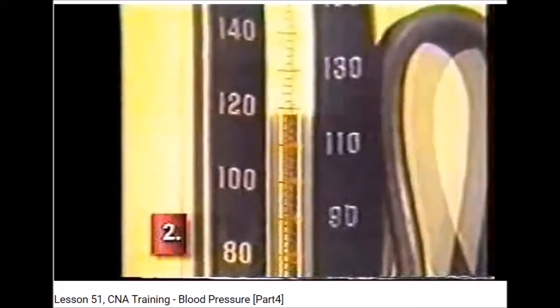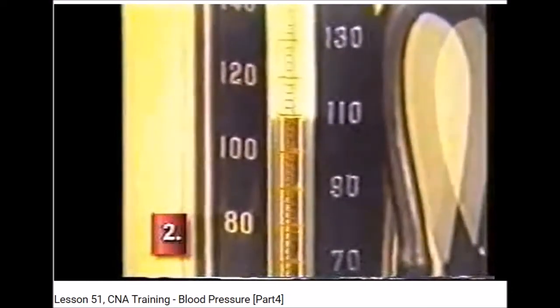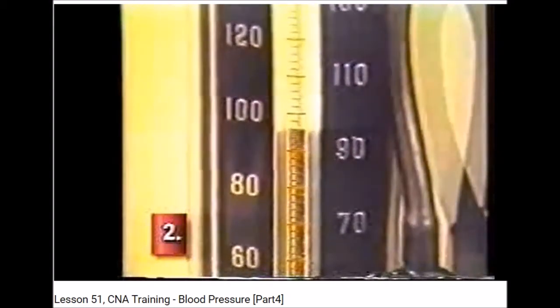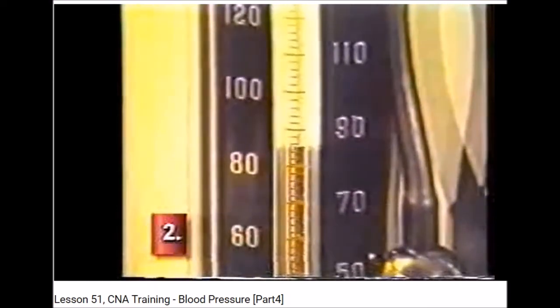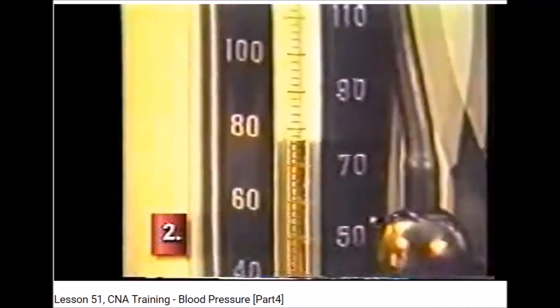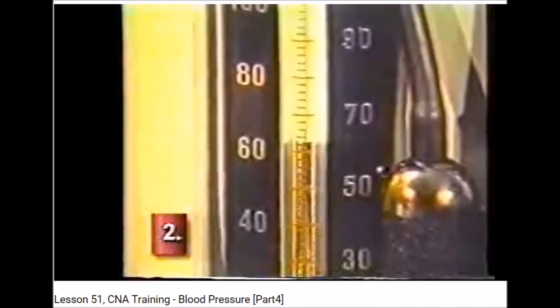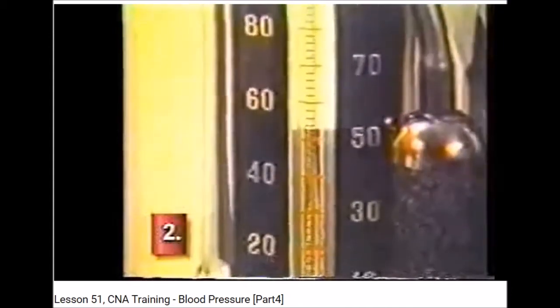Here's another patient. See if you can determine when you first hear the heartbeat. Right about there, 110 is the upper number or the systolic pressure for this individual. This person has a much lower blood pressure than the first patient. About 62 is the diastolic pressure for this individual.